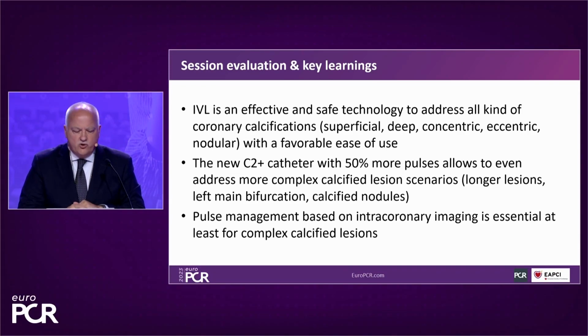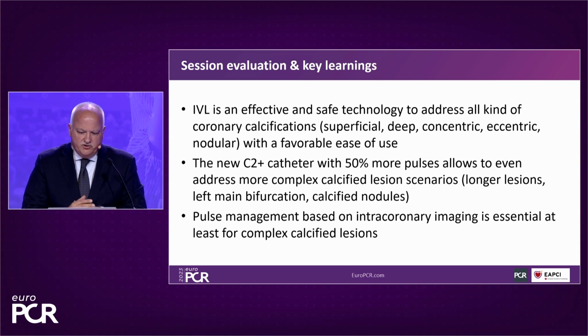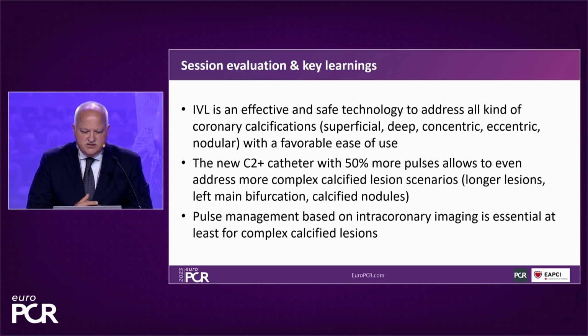I think it's now time to conclude that session. I'm more than happy to do that. So I think we had a quite fruitful session, and I tried to bring it down to 3 bullet points you can see here, which is summarizing what we have seen and heard. First of all, IVL is an effective and safe technology, no doubt about that, to address all kinds of coronary calcifications with a favorable ease of use.